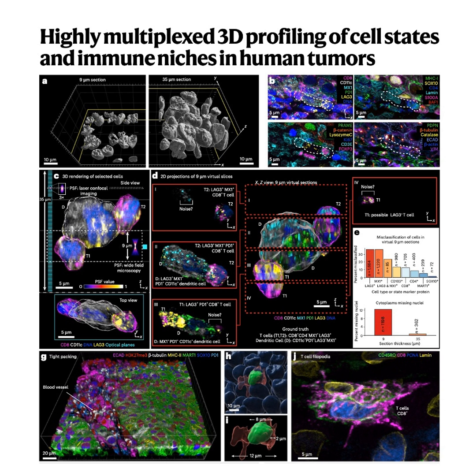Right, 3D CyCIF. So that's our mission for this deep dive. Getting into the weeds of this technical paper, we're going to reveal some, honestly, stunning evidence that these conventional 2D tissue sections leave hardly any cells intact, almost none. And that severely compromises key biological insights, like figuring out what type of cell you're looking at or how cells are actually interacting. So let's start there. Let's define this massive problem, the flaw in 2D.